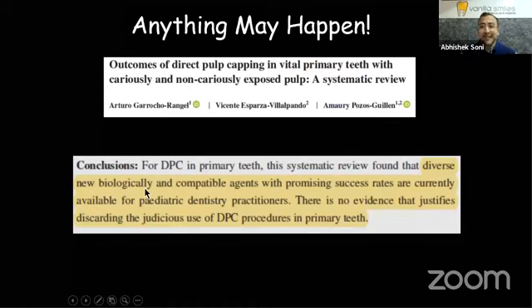So a lot of us begin with the end in mind, wherein we are reading the radiographs. We see that the cavity is probably ICDAS 6, and we inform the parents that this particular tooth is going to need a root canal treatment. However, you have to amalgamate your clinical signs, you have to amalgamate your radiographic signs, and eventually go selective removal, and then decide whether the child needs an indirect therapy, or whether the child needs a direct pulp capping, or whether the child needs a pulpotomy, and then your pulpectomies come into picture.